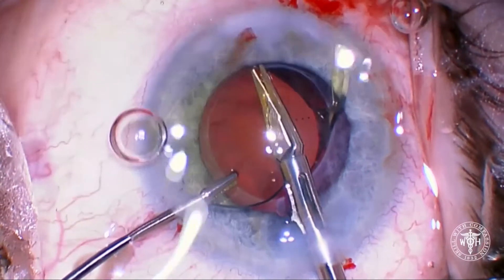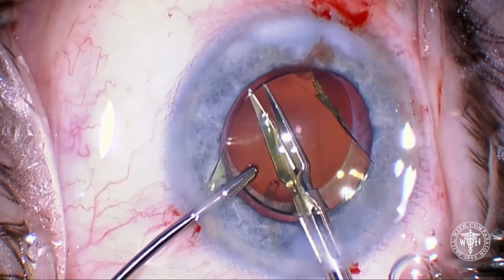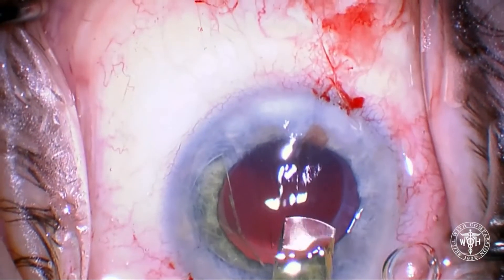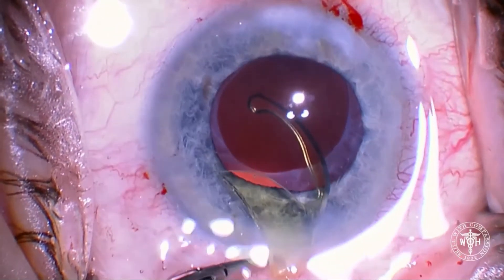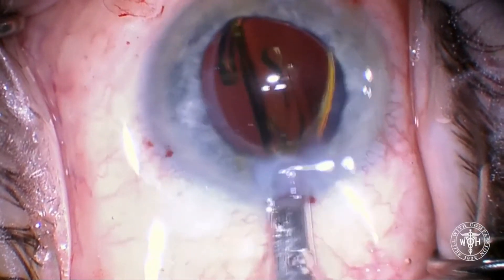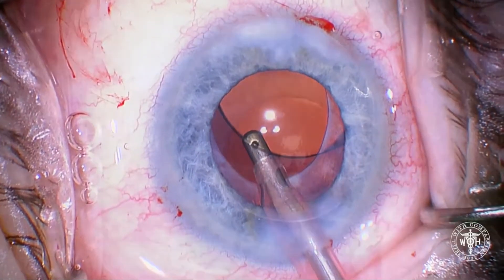This is not a spin move because likely the other haptic is still incarcerated in the capsular bag — so you lift these implants up into the anterior chamber. Using the Packer-Chang IOL cutter and a micro forcep, you remove the existing implant through your main incision and then place your new implant. Make sure the capsular bag is completely open — I'll often work hard to free the capsule at the haptics but not 360 degrees around, and the new IOL won't seat properly because the haptics are trying to open into an unopened area. If we were placing a toric at a different axis, we'd need the capsular bag fully open. In this case it's a spherical lens, so as long as it goes back where the old one was, we're fine — from here on it's just a regular cataract case.